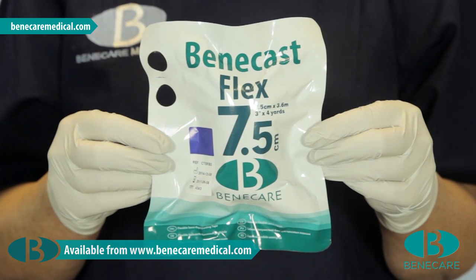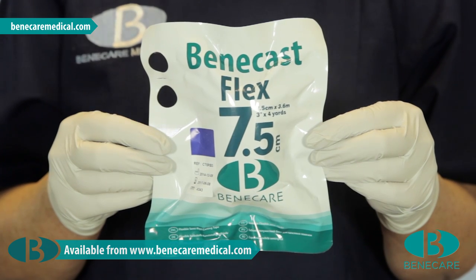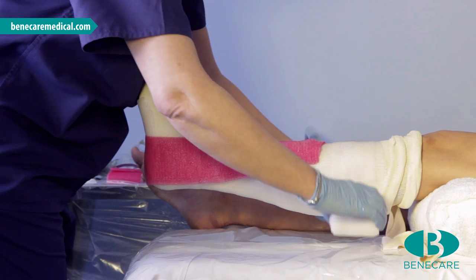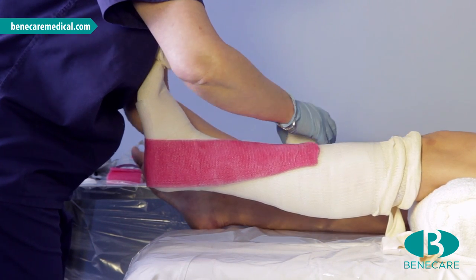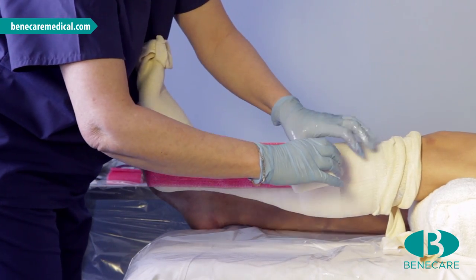Secure the splint using the second roll of Benecast Flex. To speed up the setting time, wet the bandage. Start bandaging at the proximal aspect, covering 50% of the previous turn, ensuring the splint is fitting securely around the heel.